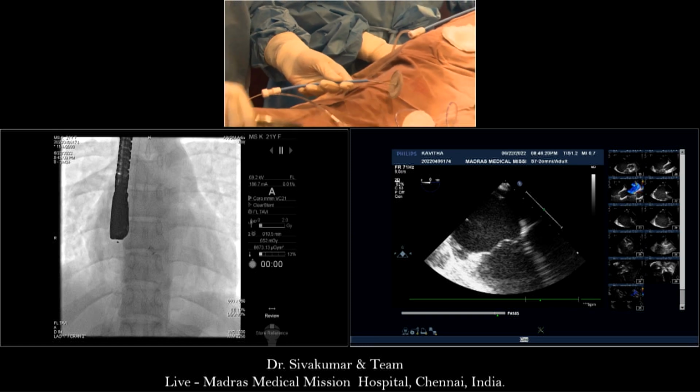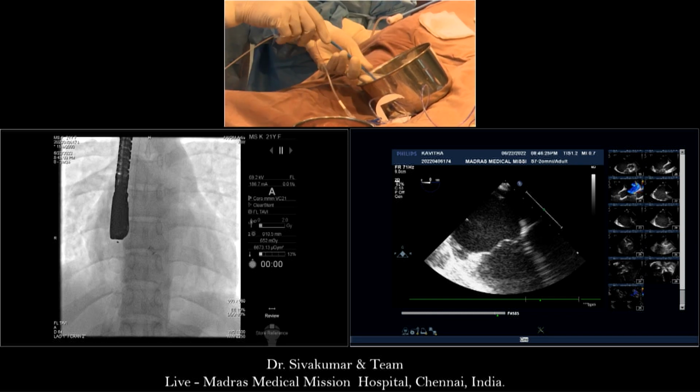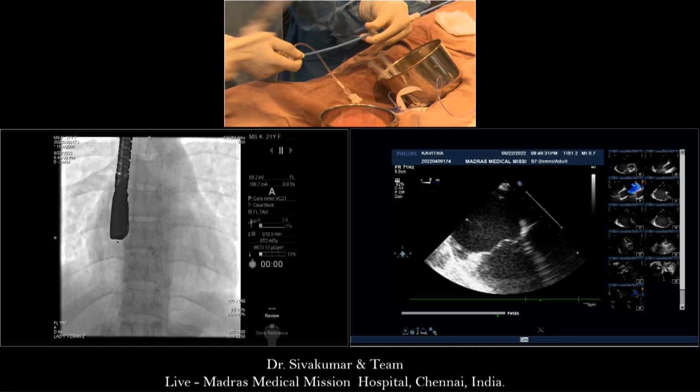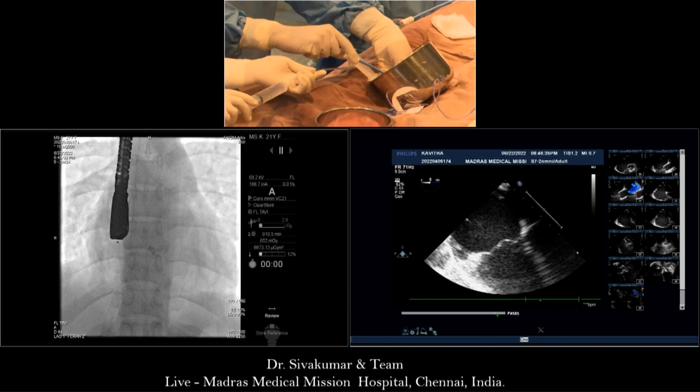And Steve, that's why I said several times, it's your patient, it's your decision, you should do what you want to do. And we really appreciate in the room that you chose to take it out and put a smaller device in, which we all agree, I think, apart from Zahid, that it's too small. So let's ask the room.